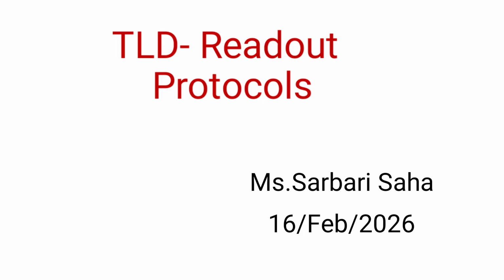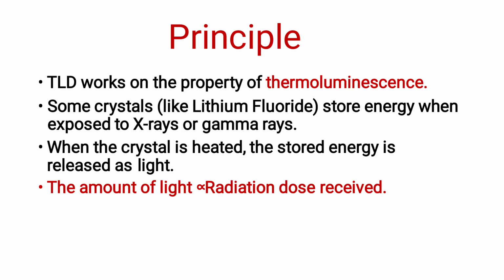So today again we are here with a new topic where we will be knowing about how a TLD batch is read out. So without further delay, let's move on to our topic. Before we move to our topic, TLD readout protocols, let's know what actually a TLD batch is.